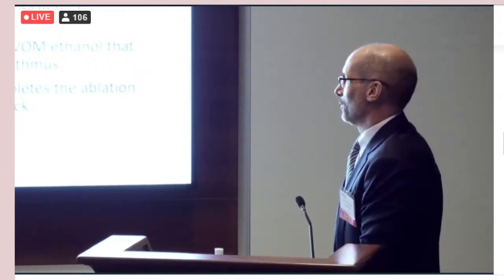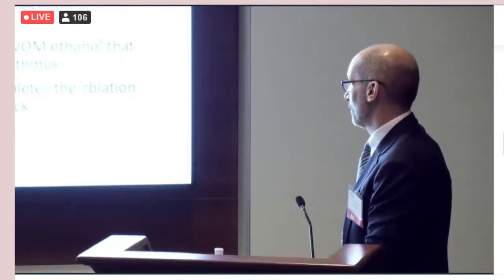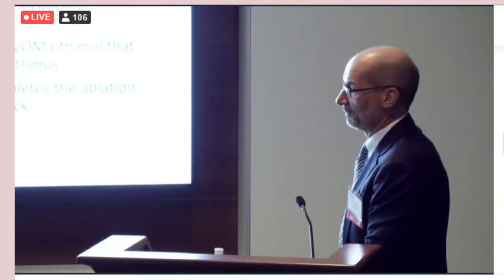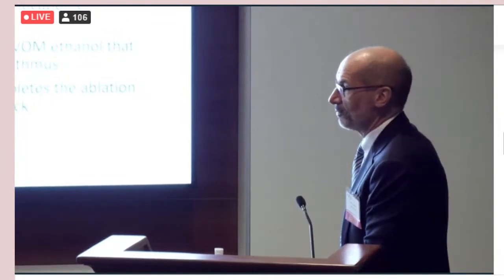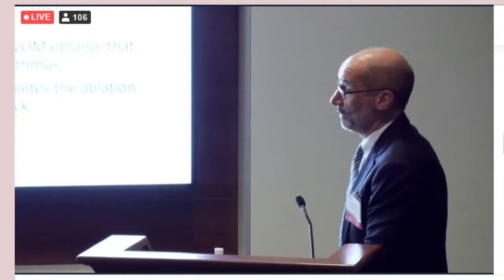I think it depends on your practice. So if your practice is 99% paroxysmal AFib first cases, you don't need this. But if your practice includes redos with atypical flutters, this is extremely useful.